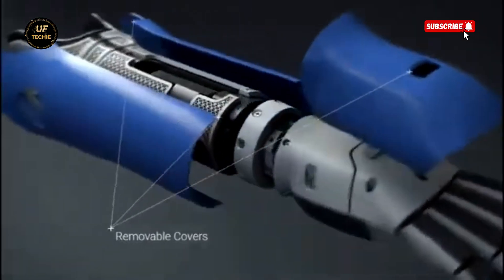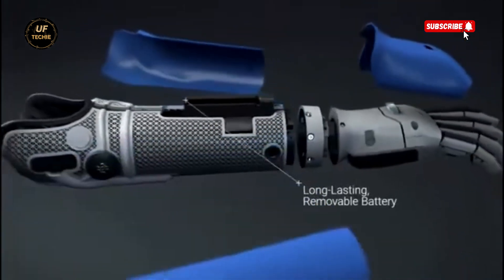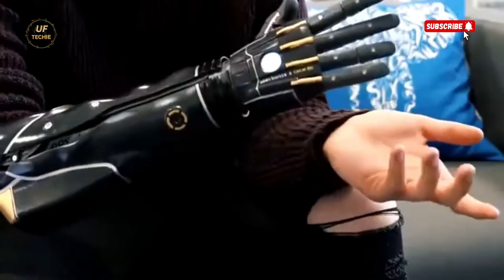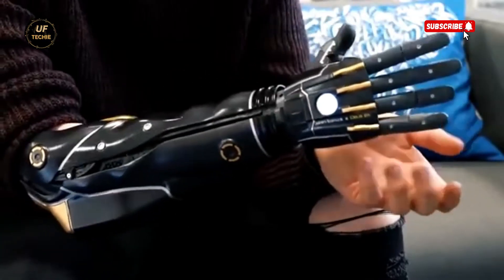It can perform multiple grip patterns, such as the power grip, pinch grip, tripod grip, and hook, enabling users to carry out everyday tasks like opening doors, writing with a pen, using cutlery, or even tying shoelaces.